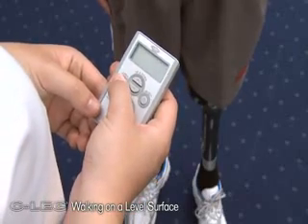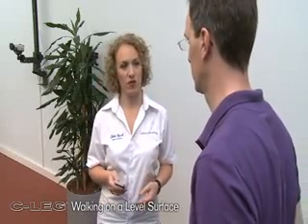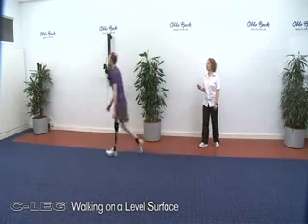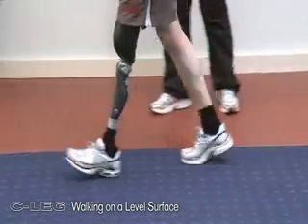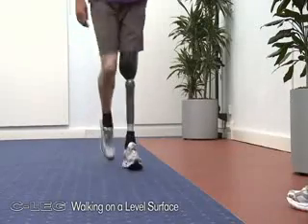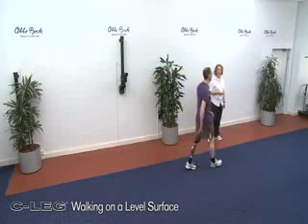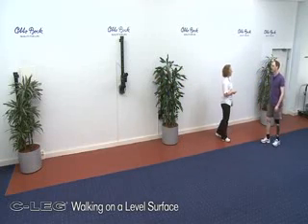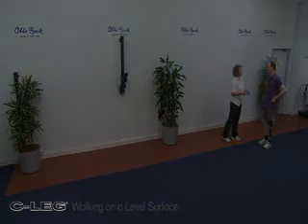Using a metronome may be helpful in order to achieve a symmetrical distribution of the stance phase duration. The therapist can set the rhythm in order to specify various walking speeds for the patient. Changes in the walking speed are required during everyday life, for example when crossing a street, catching the bus, or while window shopping. Such speed changes are possible with the C-leg.